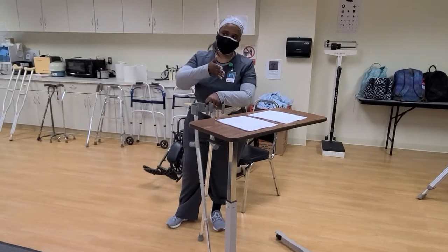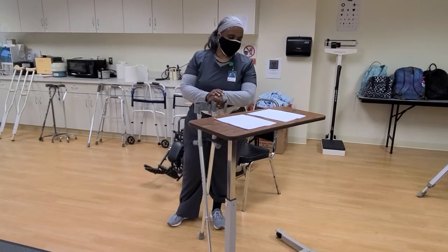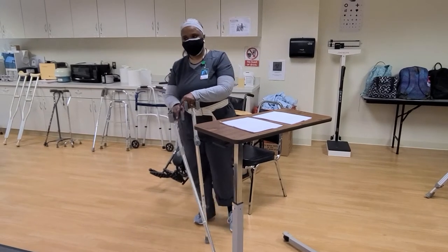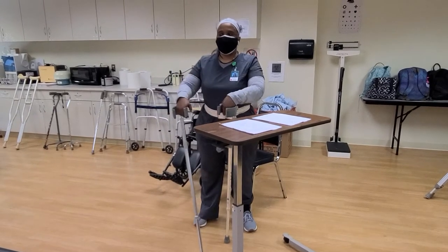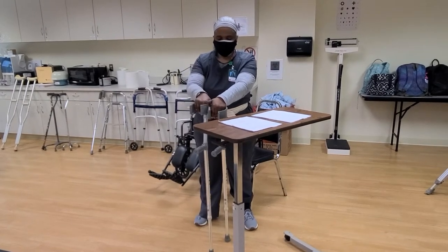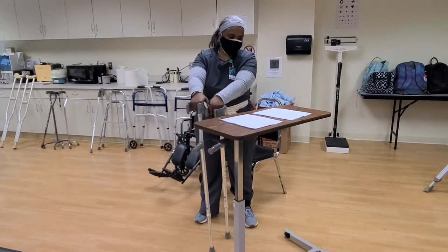Lofstrand — you can put slash Canadian slash forearm crutch. So this is called the Lofstrand, Canadian, or forearm crutch.